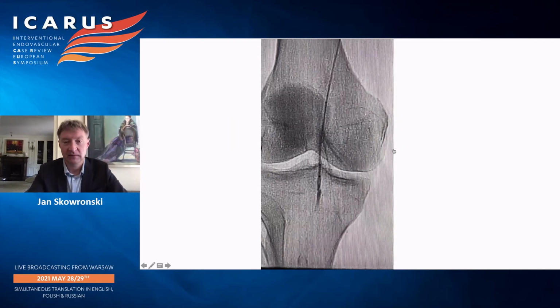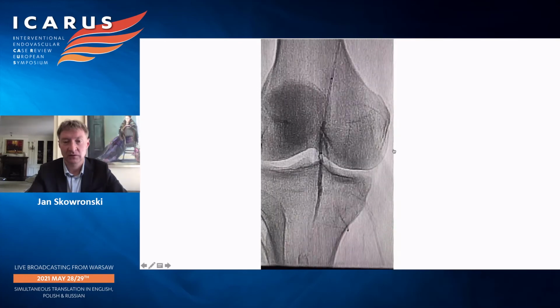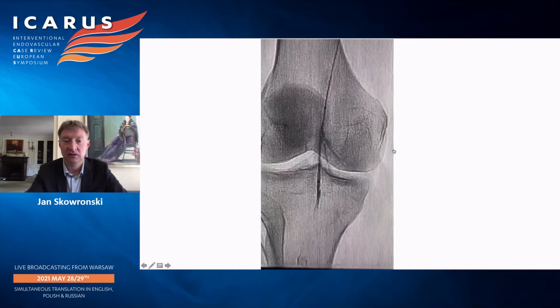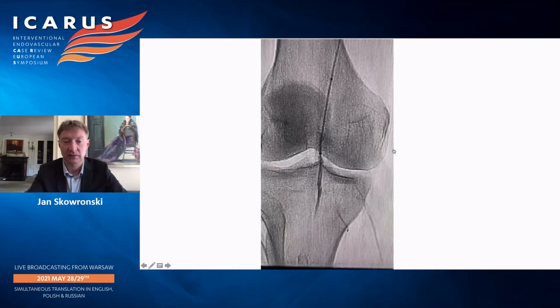This is a case where we crossed a long chronic total occlusion. We are in the popliteal artery subintimally, not a great spot for a reentry.